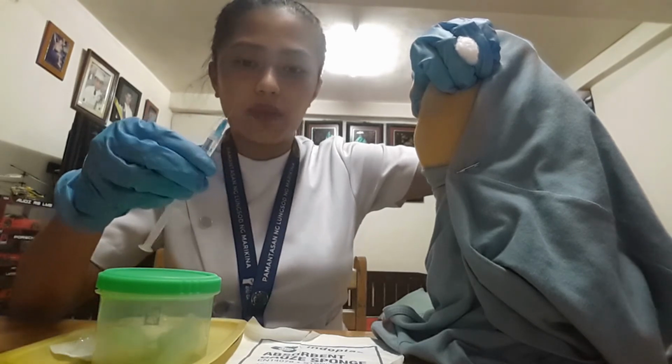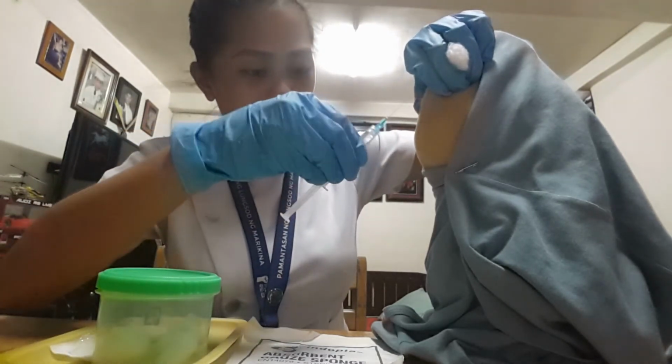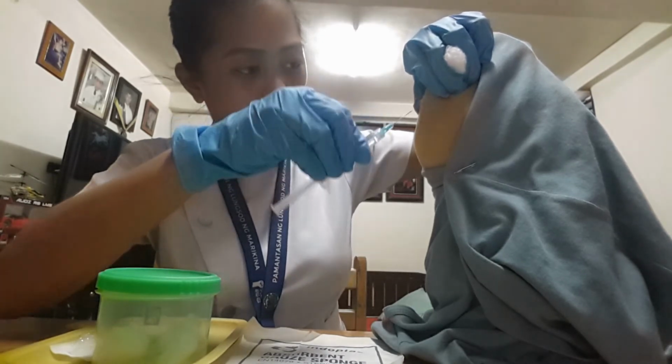And then next is I need to insert the needle at approximately 45 degrees. 45 degrees. Make sure that the bevel is always up.